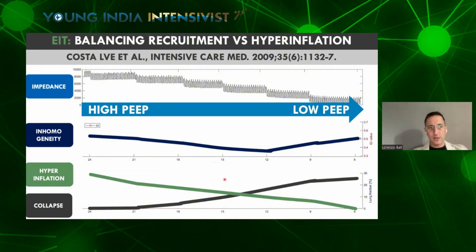It is not yet demonstrated by large trials, but it's very intuitive that we probably want to set the PEEP around these values. We want to balance between hyperinflation and collapse. Several protocols have been proposed, most of which suggest finding the intersection between the decreasing hyperinflation and the increasing collapse, and setting the PEEP 2 centimeters above the crossing point to find the best compromise between collapse and hyperinflation.